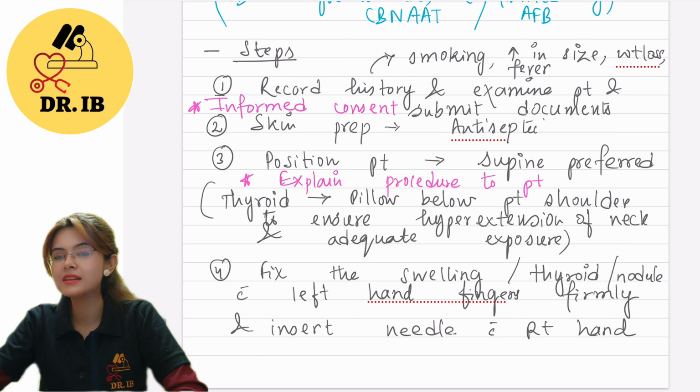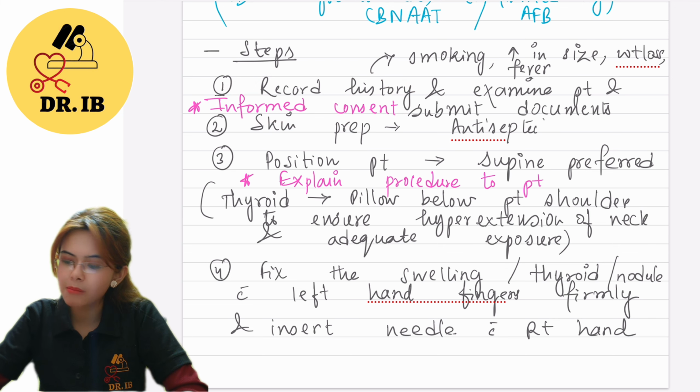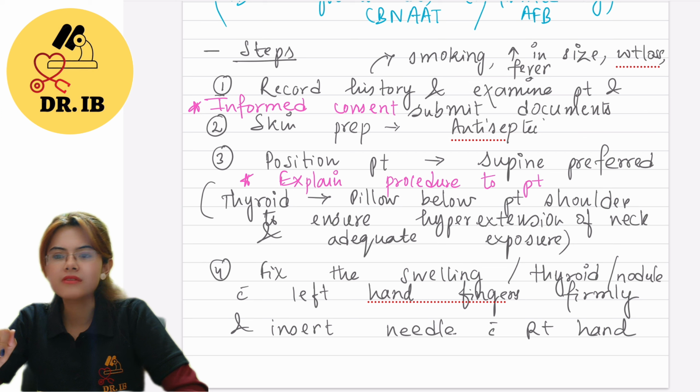Just make sure that you're understanding the profile of the patient before you jump into the aspiration. Now, yes, you have to take informed consent. Sometimes you do take that. Submit the document that is required. Now we'll start with the procedure, okay?